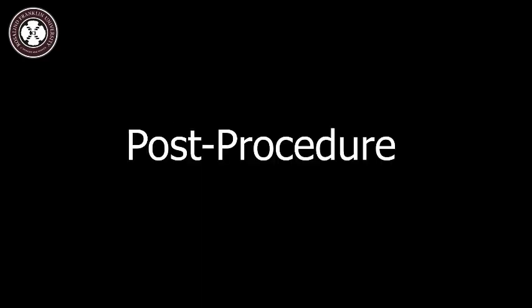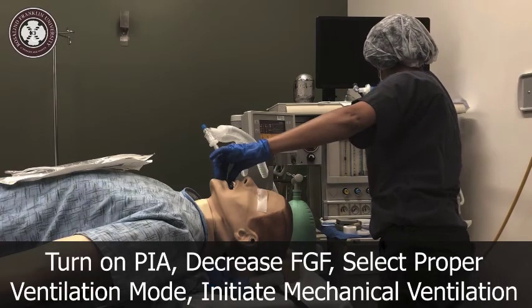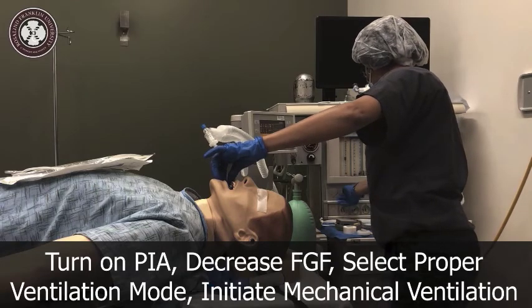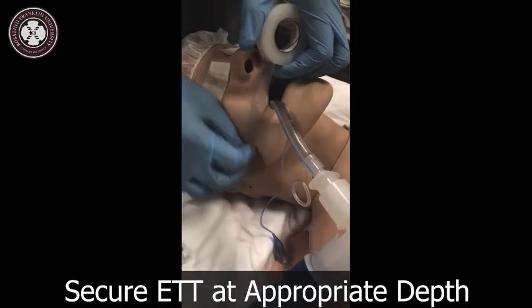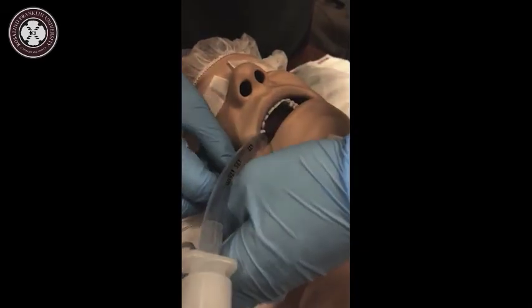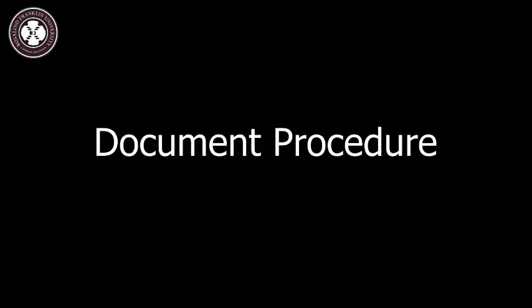After the endotracheal tube has been properly placed, turn on the selected potent inhalation agent, decrease fresh gas flows, choose a proper ventilation mode, and initiate mechanical ventilation. Secure the endotracheal tube at the appropriate depth with tape. Finally, document the procedure.